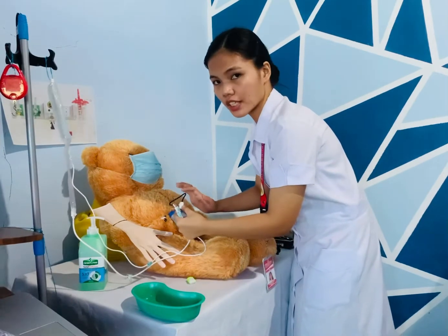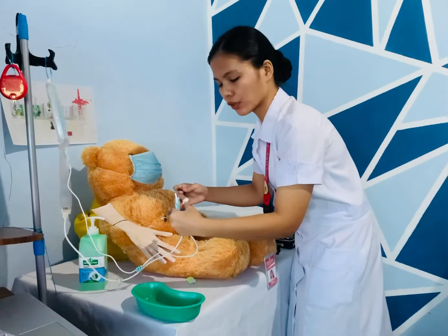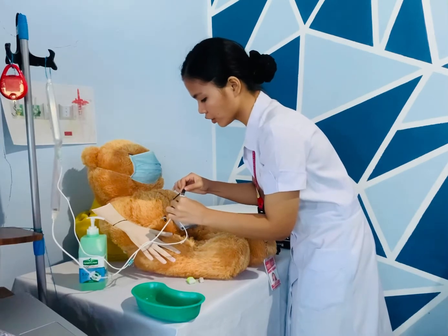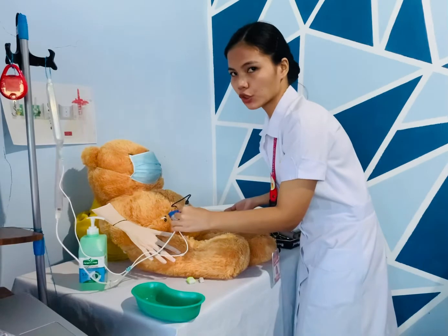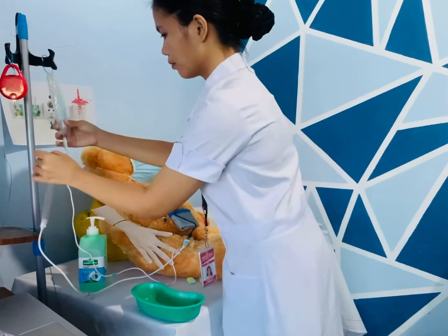yung transfer set, remove the mini cap. Ayan. Then remove the mini cap carefully, then drop it again to the ground. Okay, then connect the patient connector to the transfer set and make sure na nakasecure ito. Then after that, place the drain bag into the basin.